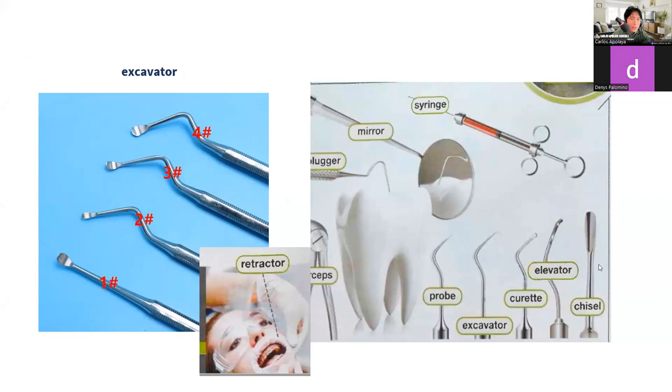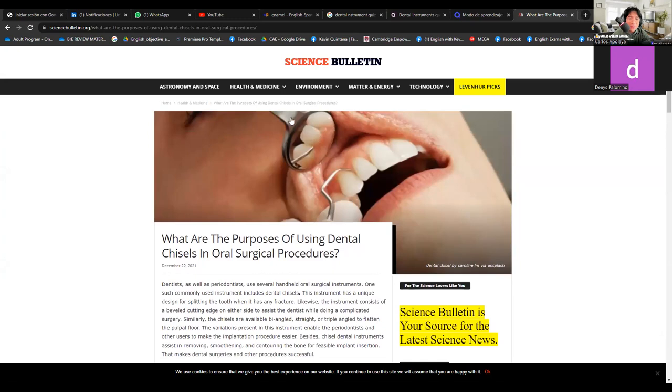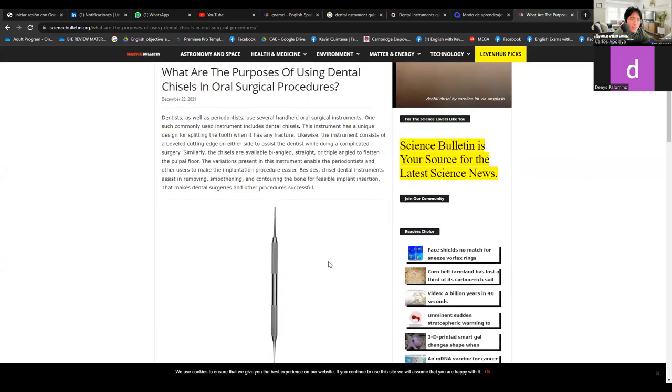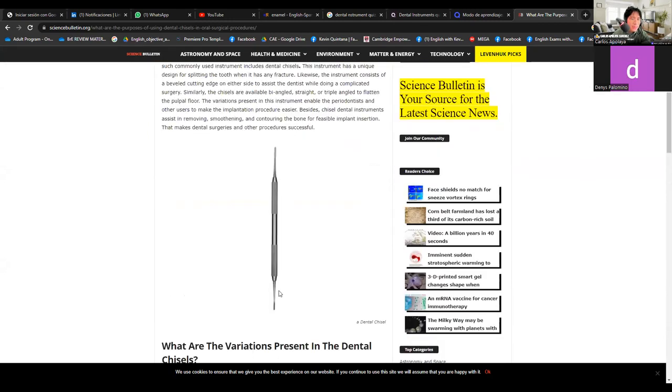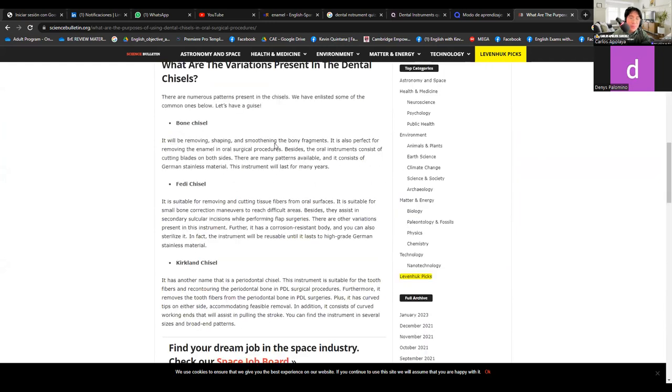Let me share the screen. Yes. Look, this is the mirror, right? And what is that? This one, the probe. You examine the teeth, right? The teeth, the cavities. Yes, but you don't examine the mouth. Yes, you're right. What are the evaluation of a dental bone chisel? Yes, you use a bone chisel. It will remove and shape and smooth the bony fragments.